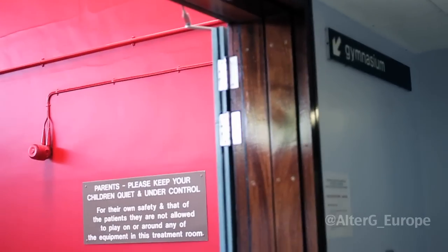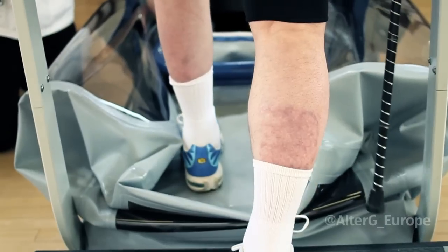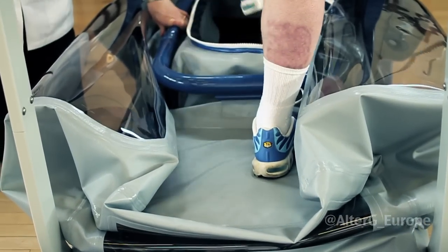I had a car accident two years ago which left me severely disabled — broken ankles, broken legs, broken and dislocated hips. In the last two months I was introduced to the AlterG, which brought me from a position where I was only able to walk 30 metres to eventually being able to walk 1.6 kilometres in 30 minutes.